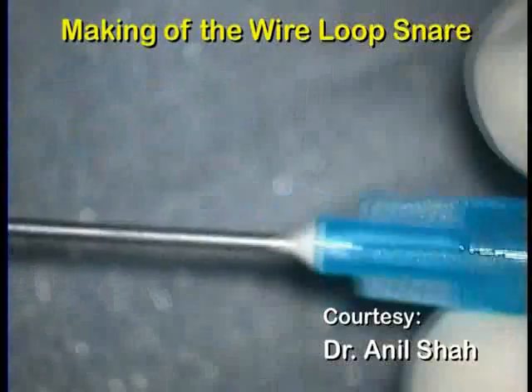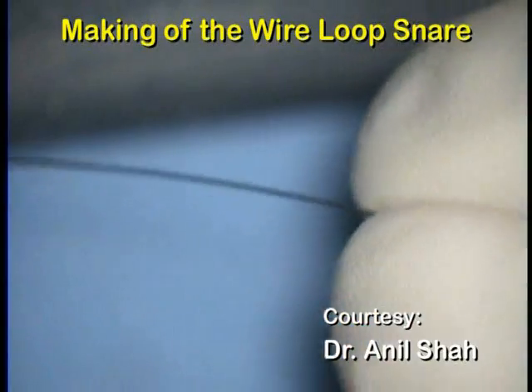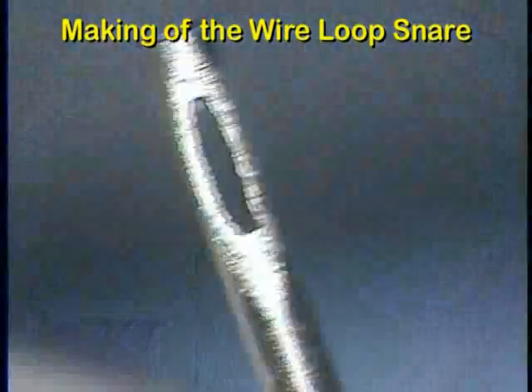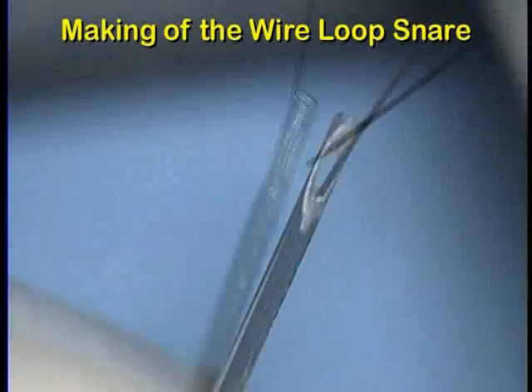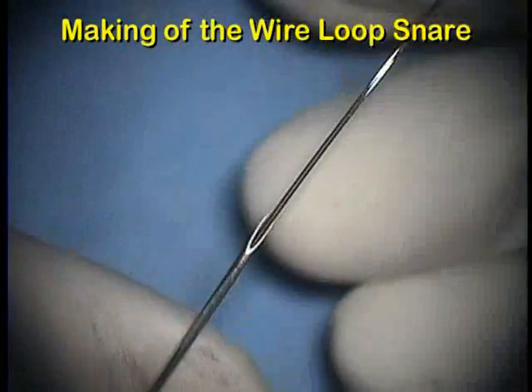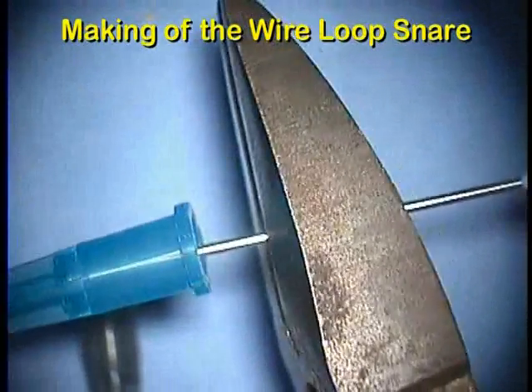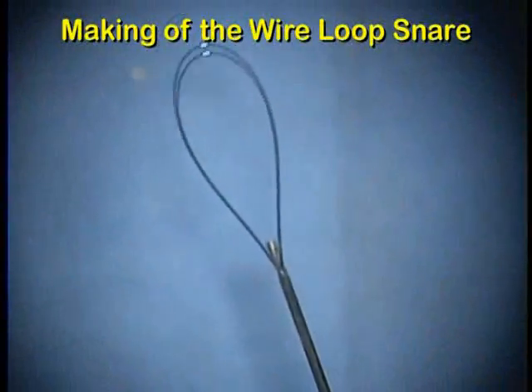The wire loop snare can be simply made using two 20-gauge needles and the A1 first string of a Spanish guitar. The tip of the needle is blunted by rubbing it on pumice stone, and two side openings are similarly made. The A1 string is threaded through one opening and then through the other. The open ends of the string are passed through the second needle, and the wire is secured by pinching with pliers. The snare is then ready for use.